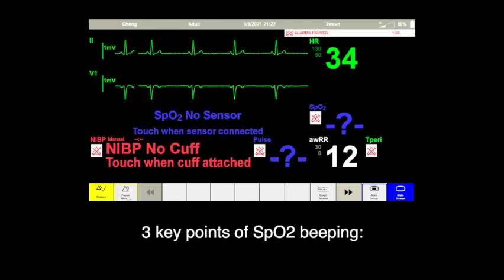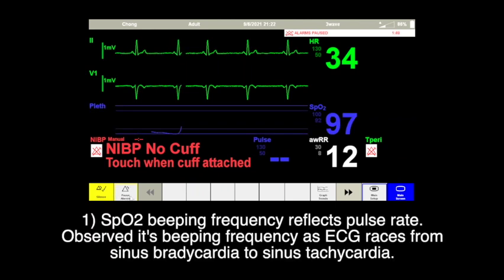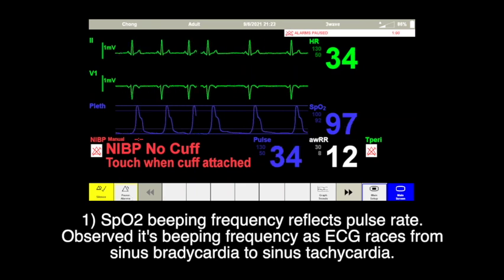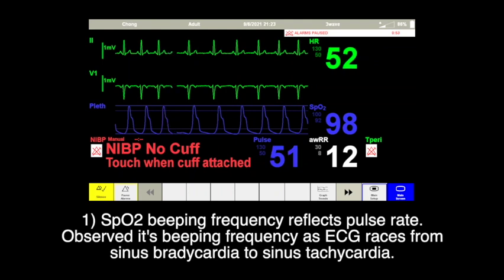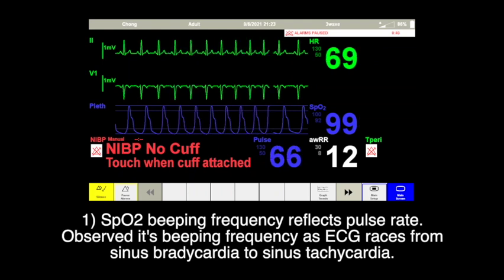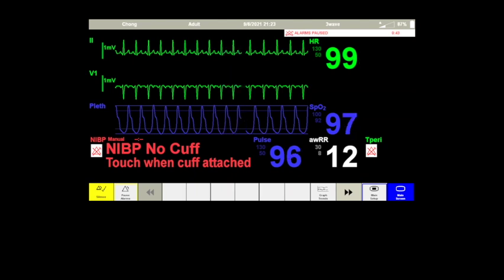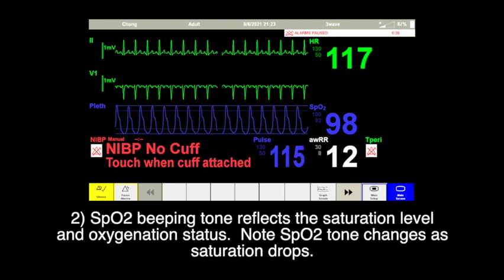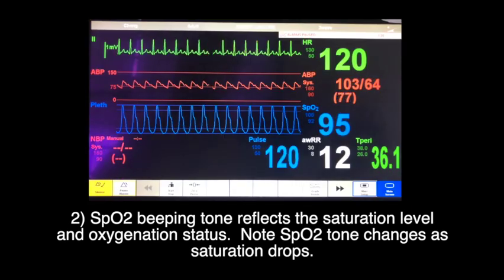There are three key points of relying on SpO2 beeping for audio monitoring. First, the frequency reflects pulse rate. Observe how its beeping frequency changes as ECG rises from sinus brady to sinus tachy. Second, SpO2 beeping tones reflect the saturation level and oxygenation status. Note the SpO2 tone changes as the saturation drops to 65%.